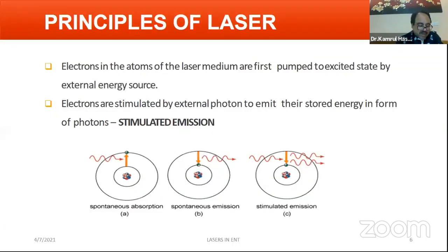The basic principles of laser. Today, lasers are used for a wide variety of purposes, including but not limited to medical, industrial, consumer electronics, and research purposes. The quantum physical basis for lasers involves an understanding of the electron energy levels in an atom, the most stable level for a given electron being the ground state, and the transition between different energy states of electrons.